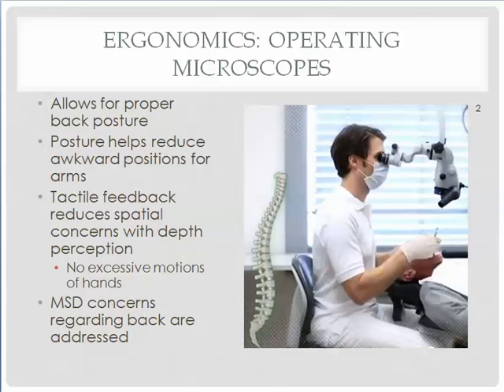A bigger advancement came in the form of the operating microscope. As demonstrated in the image, the spine is kept in the proper position and there is correct back posture. The awkward arm motion of resting the arm on the leg was reduced, as seen on the previous slide, and concerns about depth perception are mediated by tactile feedback so that accuracy is not compromised. This instrument addressed one of the two primary areas of MSD complaints.